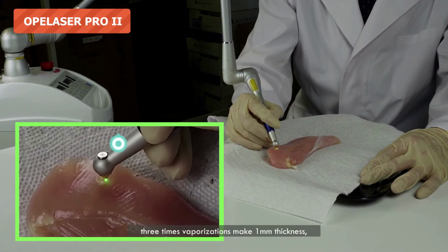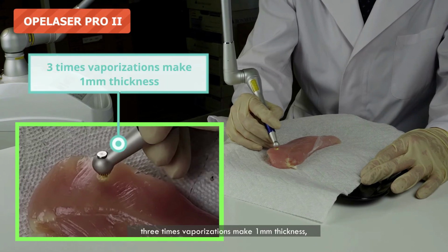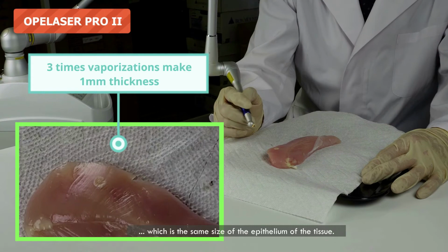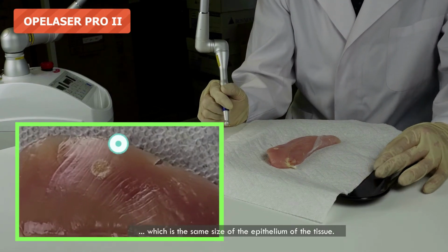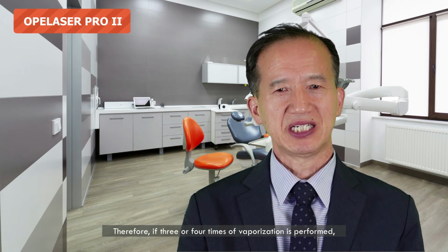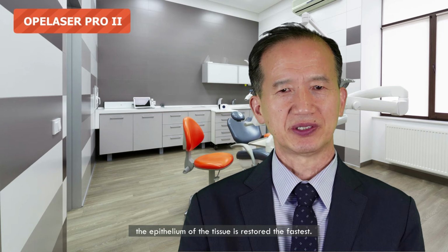Three times vaporizations make 1 millimeter thickness, which is the same size as the epithelium of the tissue. Therefore, if 3 or 4 times of vaporization is performed, the epithelium of the tissue is restored the fastest.